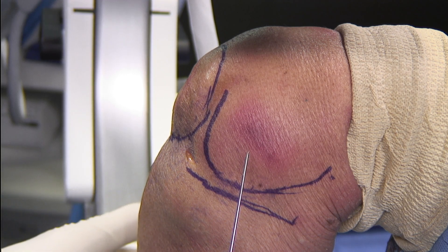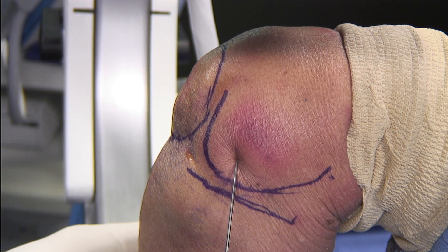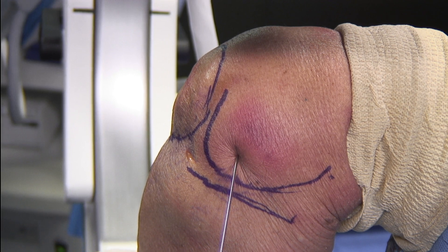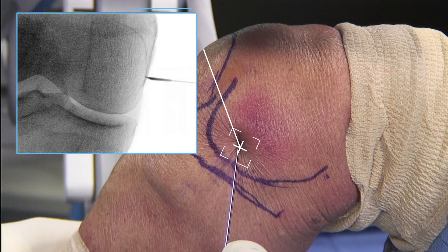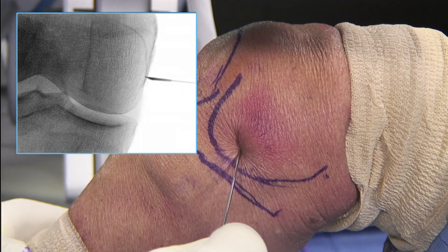I use a spinal needle for my lesion localization. I don't like to use a big pin during this part because if I create multiple holes within the cortical bone as I'm trying to target my lesion, I'm more likely to lose some of my bone marrow concentrate during those misfires. So a spinal needle is used to locate on an AP and a lateral projection. I have the MRI up so I have a general sense of where I'm trying to go. The fluoroscopic image confirms the location that I want to perform the intraosseous bioplasty with core decompression.